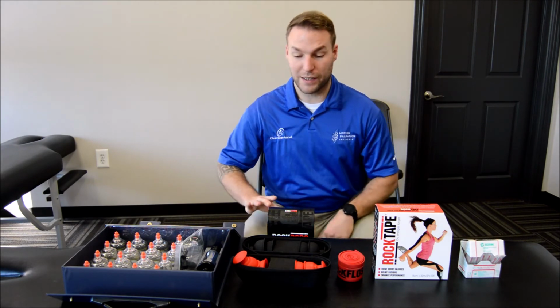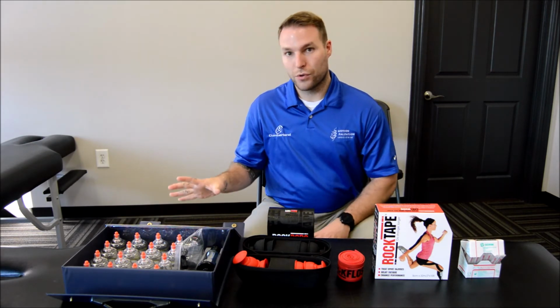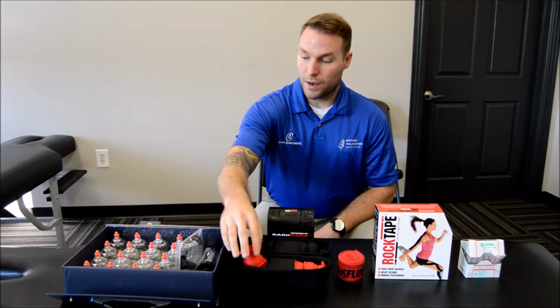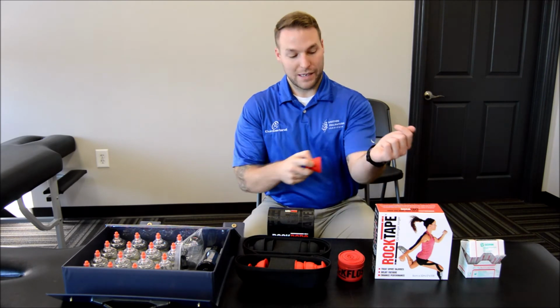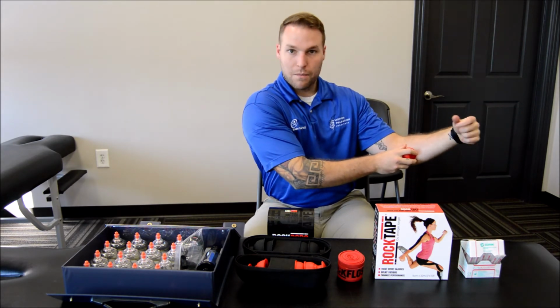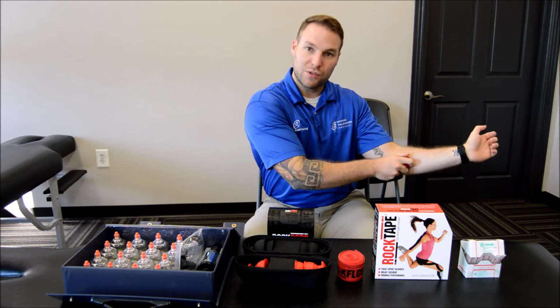A couple of other things we like to do is cupping. Now cupping, a lot of people have seen that where people have the big bruises on their back and things. I don't like to do a lot of the static cupping. I like to do, again, dynamic cupping, just like our vibration. So we have the rubber cups, and we do have a glass kind of plastic cupping set. I like these rubber ones because I can put them right on pretty much any area, provide some suction, and then I can do my muscle contraction, my tissue movement while this cup is kind of pulling up on that tissue, and we're getting some tissue sliding there.